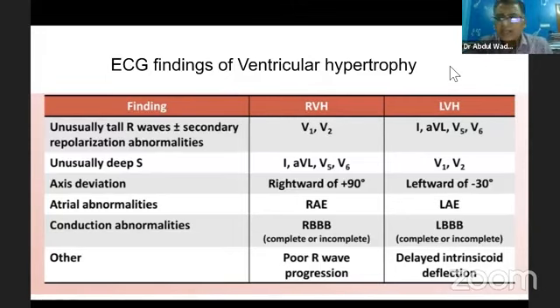This clinical connection is so important in practical life. Let's say you are working in an upazila center. A patient has come, hypertensive. He's complaining of shortness of breath whenever he carries weight. You look at his ECG and find there is only left atrial enlargement, with no evidence of left ventricular hypertrophy.